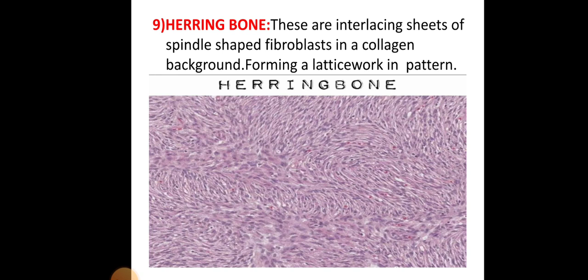The herringbone pattern consists of interlacing sheets of spindle-shaped fibroblasts in a collagen background, forming a latticework arrangement. This is most commonly seen in fibrosarcoma.